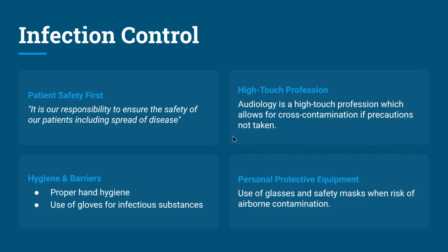We're a high-touch profession. Audiology often has items that come into contact with patients, and so precautions should be taken to disinfect the equipment that comes into contact with the patients. So hygiene and barriers, using proper hand hygiene, whether that's alcohol sanitizing solution, whether that's soap and water on your hands, or using gloves to protect yourself from infectious substances.